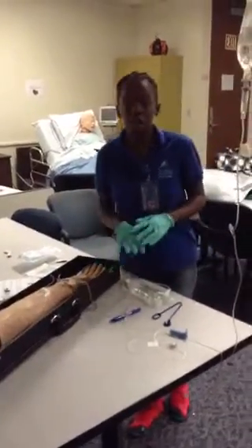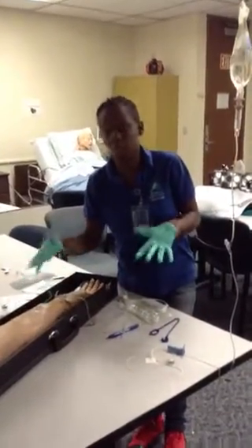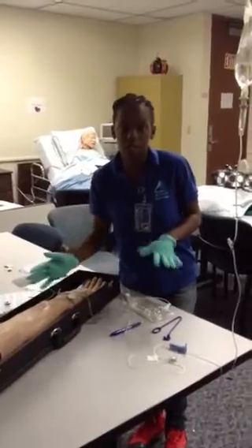Make sure it's the right patient. Explain the procedure to the patient. I'm going to assess the site — no phlebitis, no pain, no inflammation. The condition of the IV site is good.